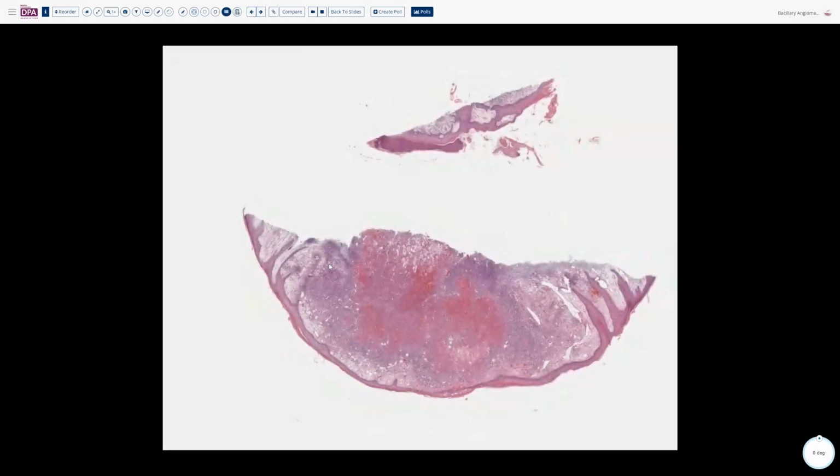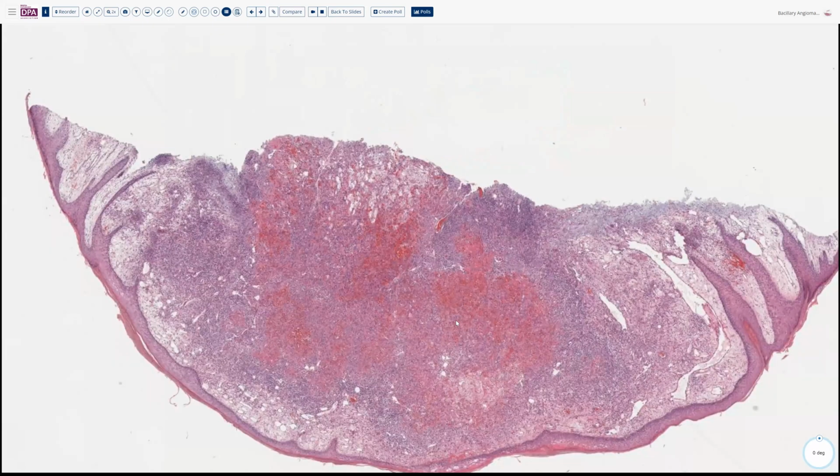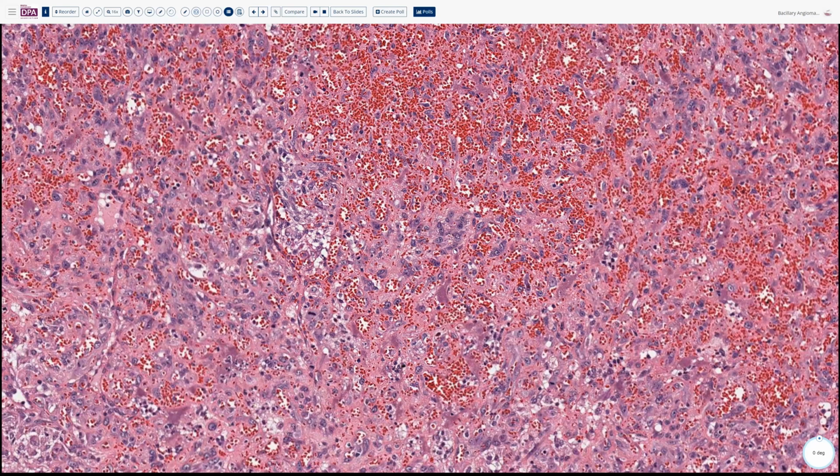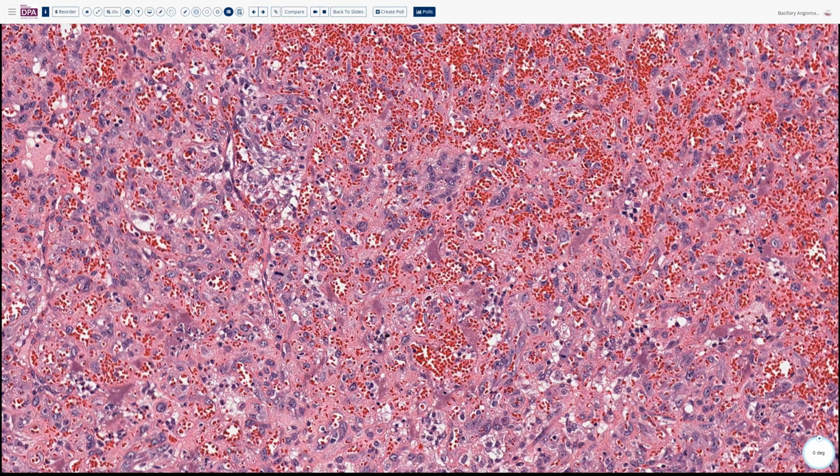And under the microscope, you're going to see, again, this sort of lobulated appearance. As you come into higher magnification, you'll see just a lot of small vessels. And also here, you have quite a bit of fibrin. But the thing that you should be looking for are these telltale clusters of slightly different appearing material. These are where the clusters of bacteria are going to be, and these are the hallmark features of bacillary angiomatosis.